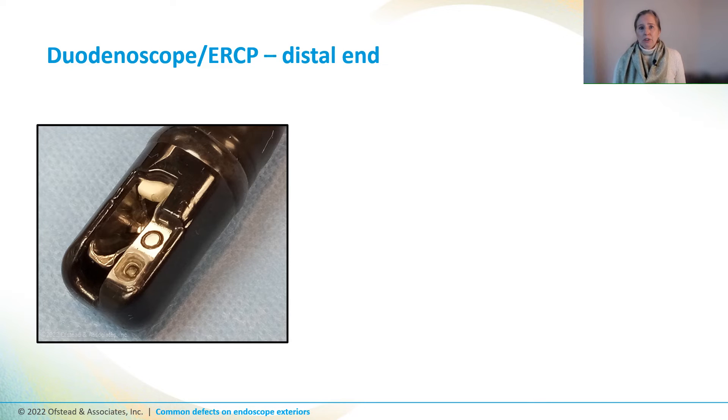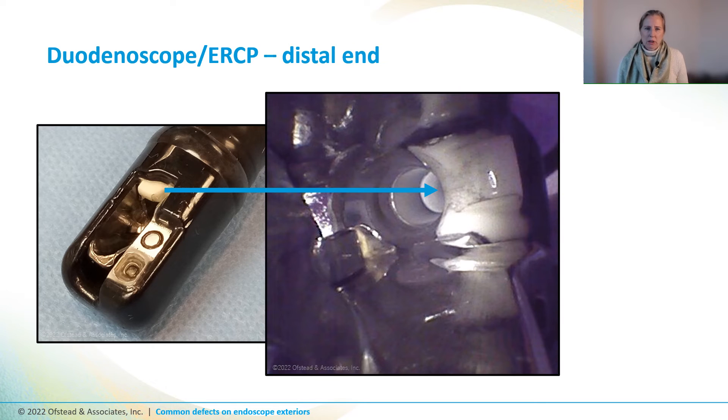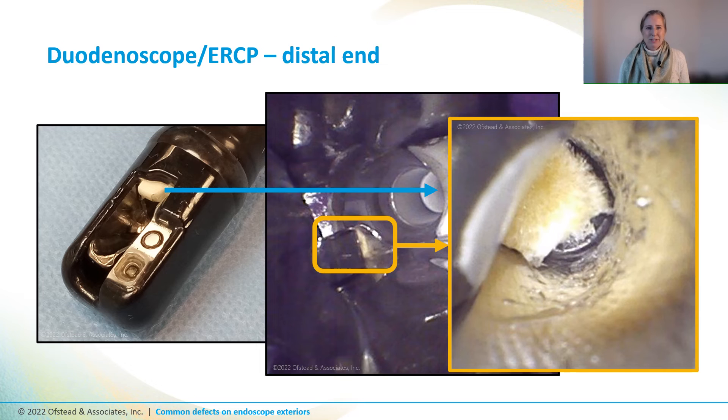Now this is the distal end of an ERCP scope, and the white component looked kind of dirty with black stuff on it. What really caught my eye was a glint of something yellow up under the elevator. We couldn't get a really good photo with a smartphone, so we used a boroscope to get under the elevator — and what did we find? Some sort of mushy or fluffy yellow stuff. We don't know what it is or how it got there, but the techs couldn't get it out, so they sent the scope out for repair.